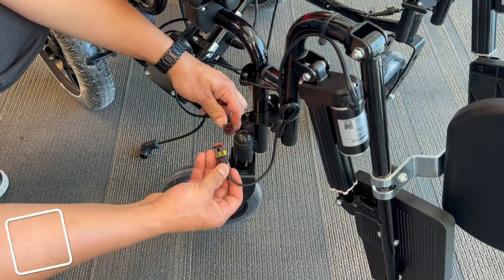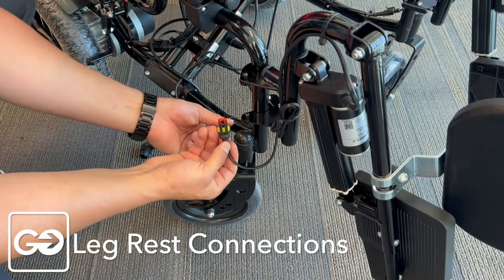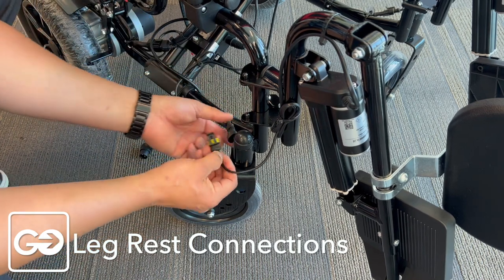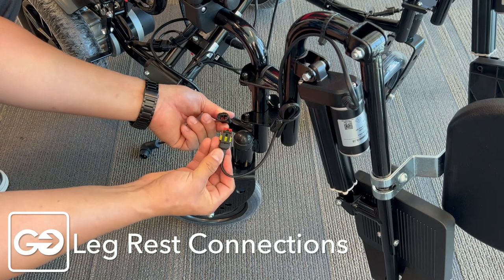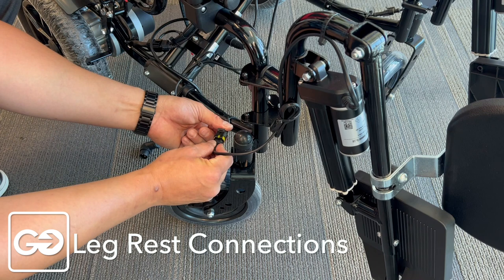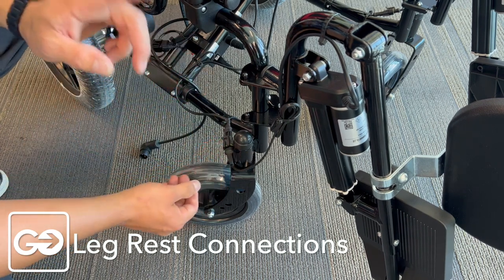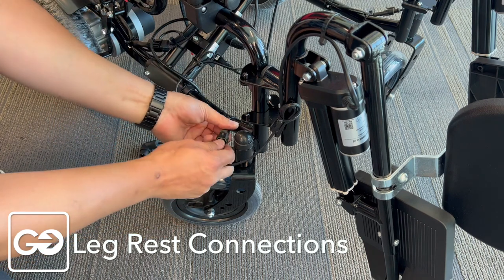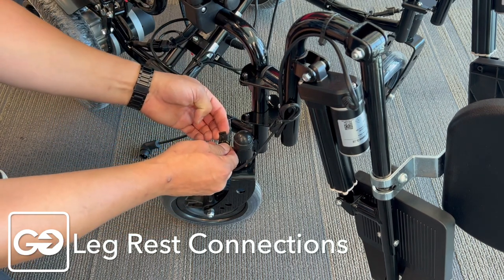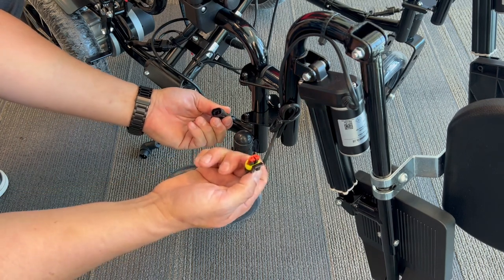Now that our leg rests are in position, we're going to connect this wire. We have a clip side that holds on and a hook side — make sure those are lined up, as it's very important to push those in. You'll hear a nice snapping sound. Once that's in position, you're locked in and good to go. Now, if you ever need to remove your foot plate, simply press up on here, take the tension off, and you'll be able to pull these apart and remove your leg rests.